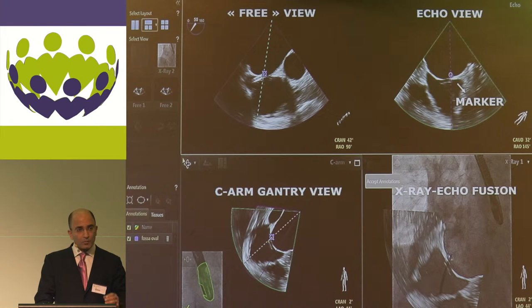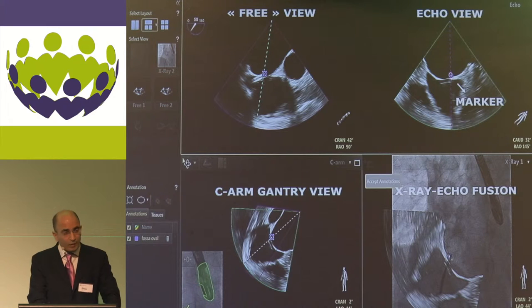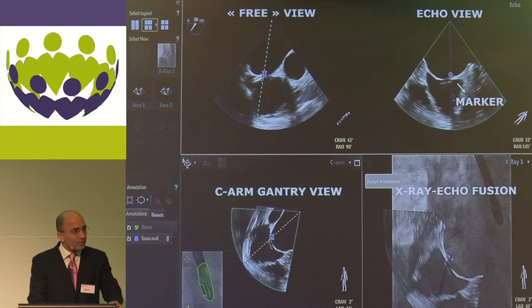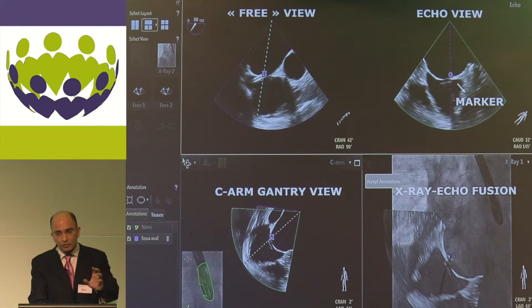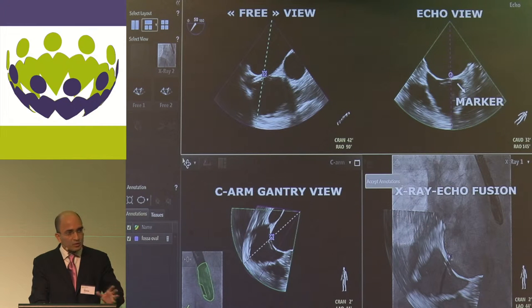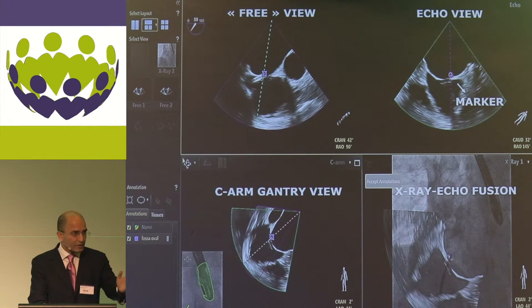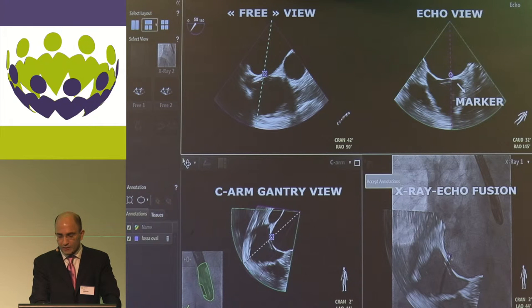The system allows you to display up to three different echo views. The classical echo view shows on the echo machine and is always available during the procedure. The C-Arm Gantry view is oriented in the same anatomic alignment as the C-Arm Gantry and is fused with the X-ray, automatically updated with each gantry movement. There is also a free view that can be rotated, cropped, and manipulated by the operator using a sterile mouse pad at the table. Additionally, a marker feature allows setting a marker at an anatomical point of interest, which can be useful for example in paravalvular leak closure.